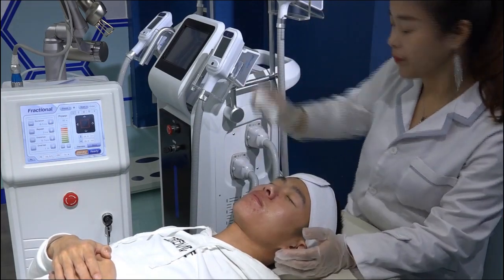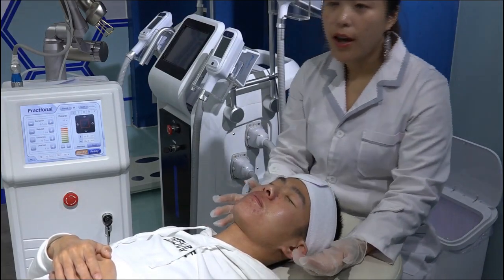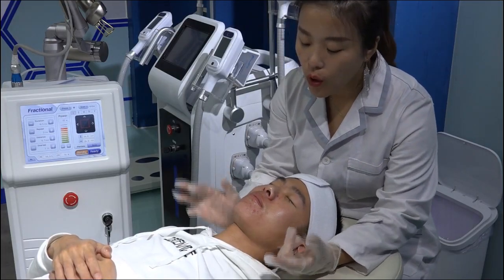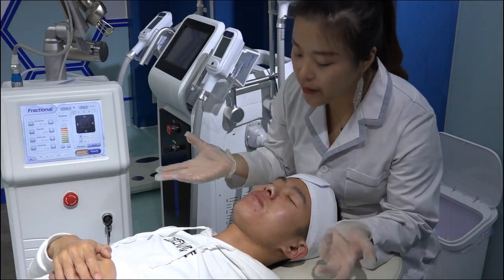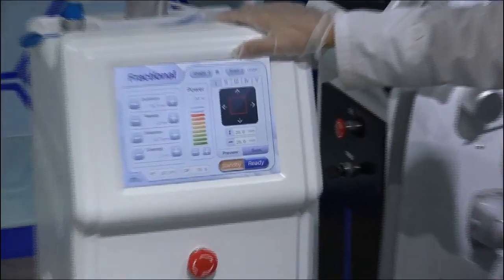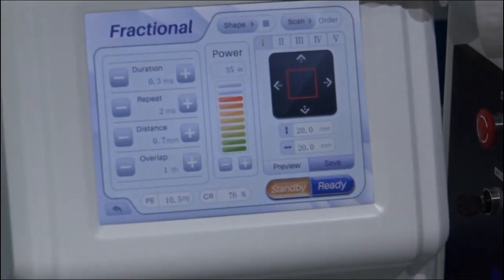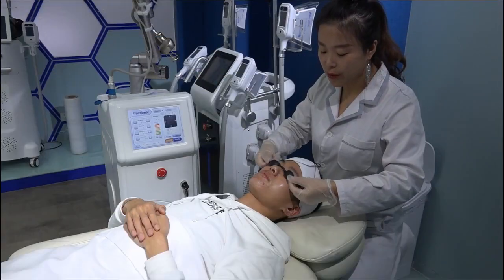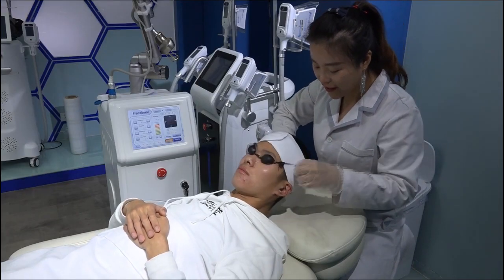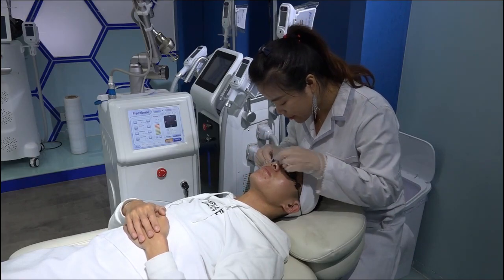Then now it's ready for the treatment. Because today we do the acne removal, we need to set the parameters well. You need to wear the protector for the eyes. Protect the eyes here.